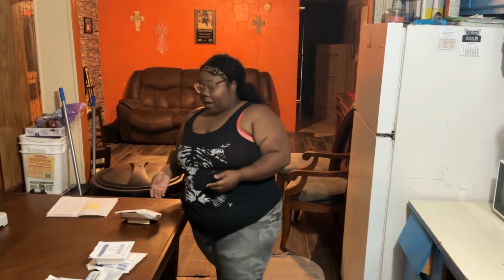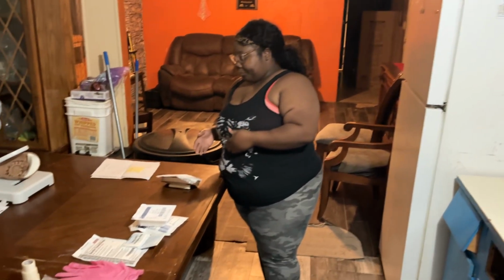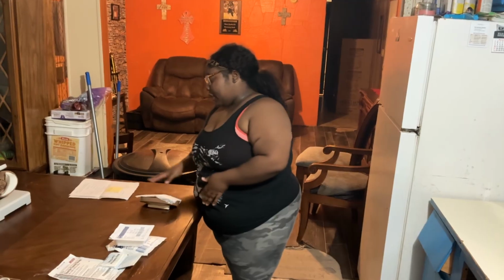Before I get started, can you provide me your name and date of birth? I'm going to assess my patient's wristband and verify name and date of birth. Patient says her name is Shalisha Qualls, birthday is 12/10/2001. Okay, great, Miss Shalisha. I'm also Shalisha, and I'm going to be doing your sterile dressing change today.